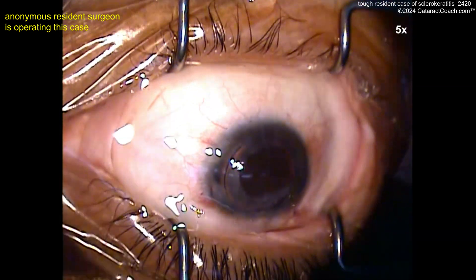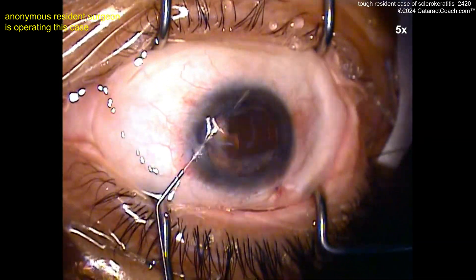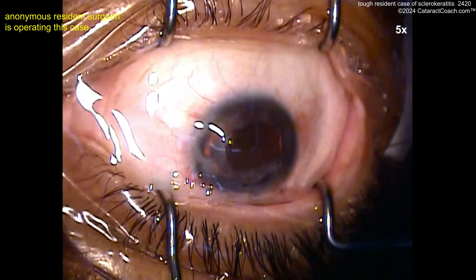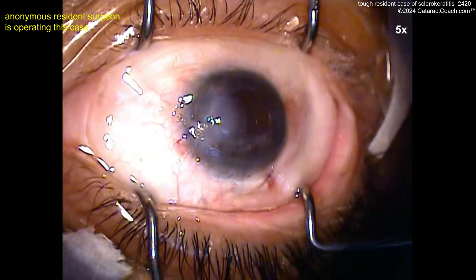This patient can have a really nice outcome here. Just don't forget to hydrate that paracentesis. Beautiful job here. So young resident, thank you for sending the video in, even in this odd-looking format.